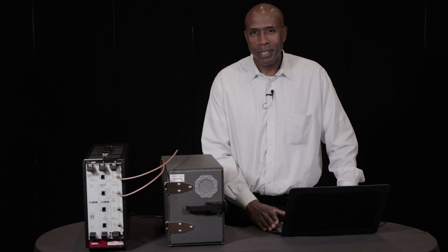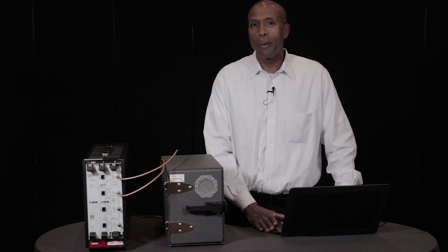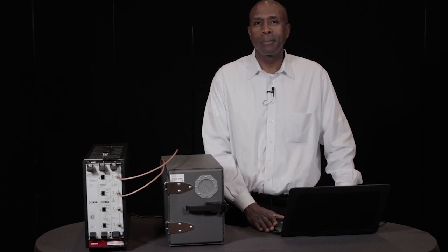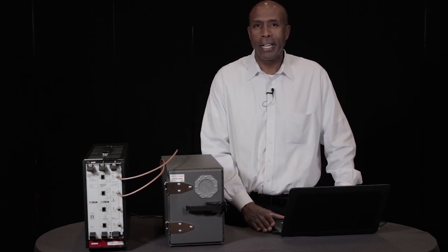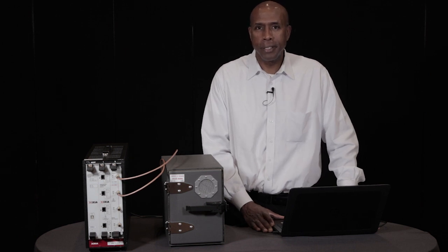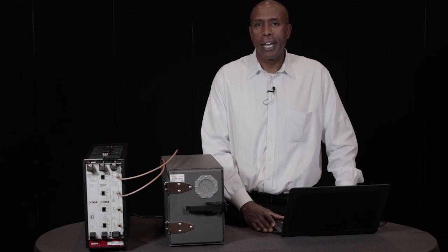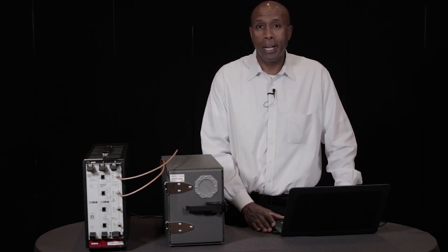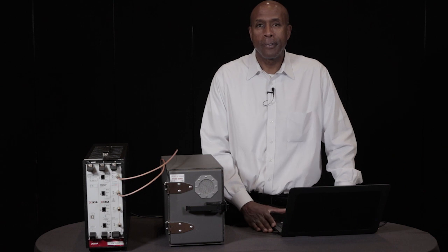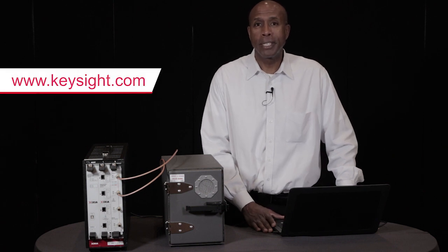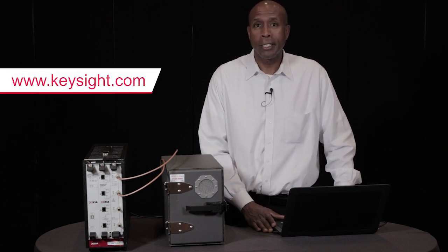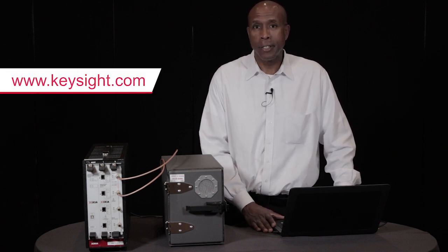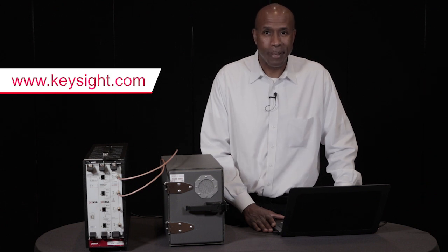This demonstration shows how the iXia VeriWave wave test system can be used to test medical devices and ensure that they're medical grade and ready for the complex hospital environment. If you'd like more information, please visit our website or contact your Keysight local representative. Thank you very much.